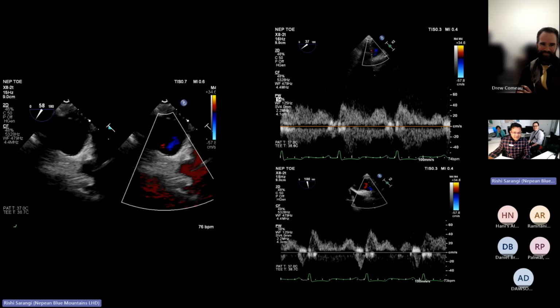And same thing we did with the right side pulmonary. It is essential to look for all four. If you're doing a TOE, you cannot get away by seeing two pulmonary veins, because as I said, with right pulmonary veins you can have just isolated blunting or reversal. So it is essential to make an attempt to look at all four pulmonary veins before you reach a conclusion.